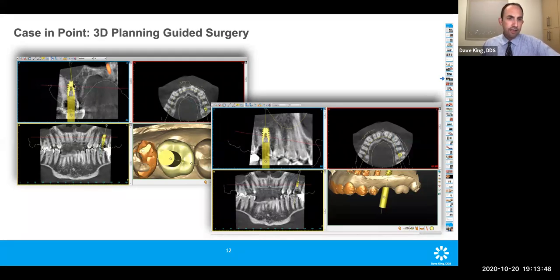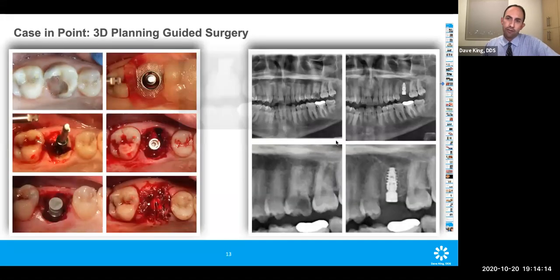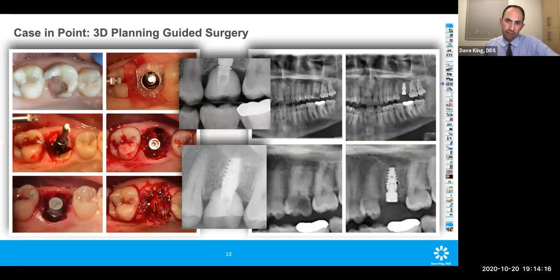This is the boyfriend of one of the benefits coordinators back in Albuquerque. He needed a tooth extracted, which was non-restorable. And so we sent him out for a CBCT image. And then we acquired that image, or he brought it into us and we uploaded it. And I got on a video call with the lab and we worked through it. Basically what we did is looked at all these different sections and slices and placed the implant ideally where we wanted it. And so in the end, the implant was placed here after the tooth was taken out.